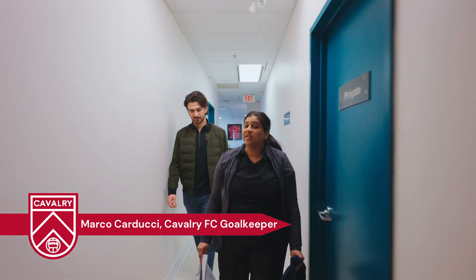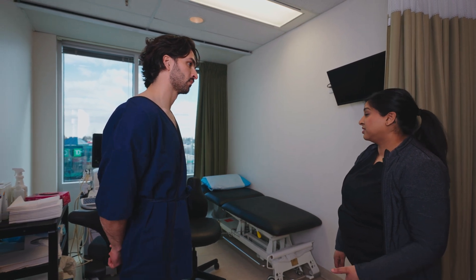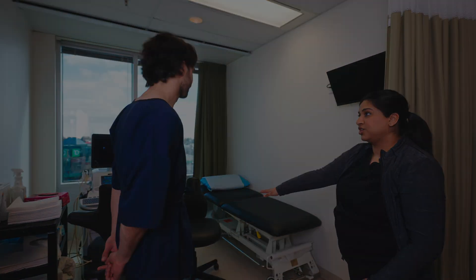Before we get started, I do just need you to change for me. Marco, we're just going to get started on your exam. Before we can get started, I just need you to get your arm out of the gown. So what I'm going to get you to do is take your right arm all the way out of the gown, tuck the loose end underneath toga style, and then have a seat on that chair.